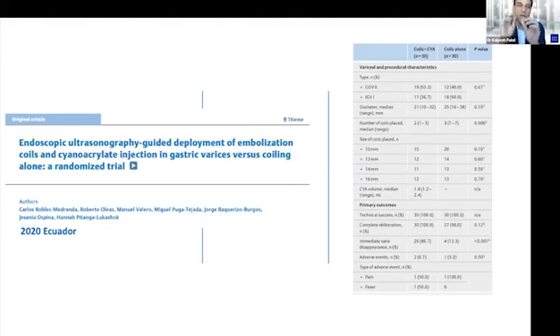Traditionally, cyanoacrylate is injected in the varix. It forms a plug to reduce further flow into the varix, and it then slowly dissolves. The problem was the amount of glue that could be required often carried a risk of embolization of the glue into the systemic circulation. So the idea here was to use coils to provide two functions.